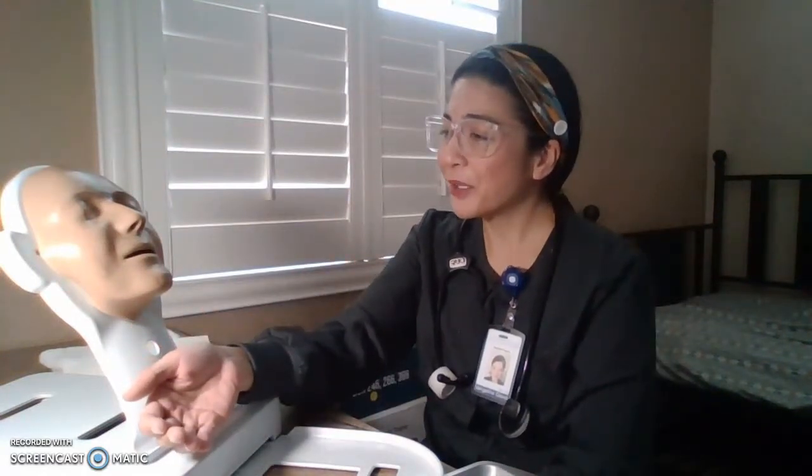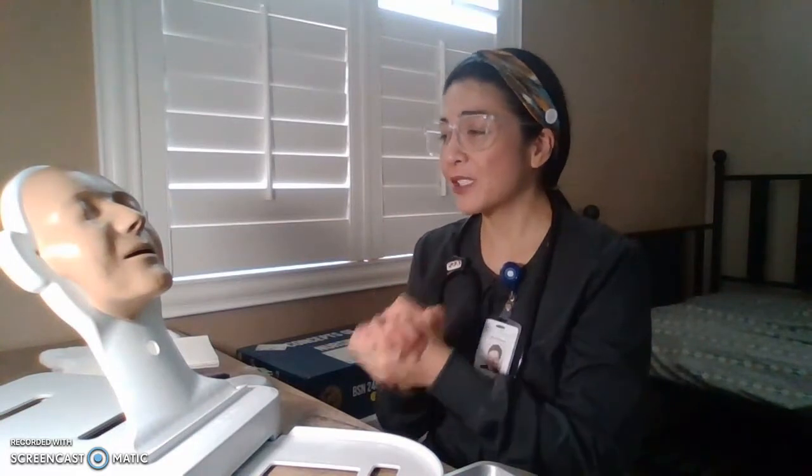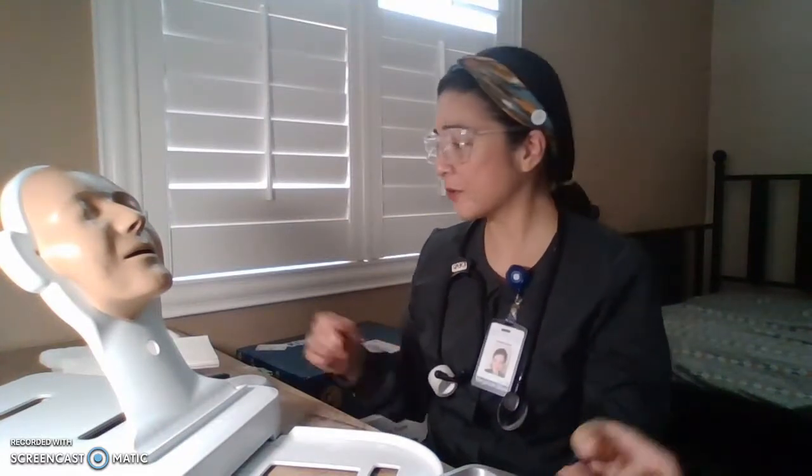Perform hand hygiene. And hi, sir, can you please state your name for me? Thank you. And your date of birth. Thank you. So, hi, Mr. Sunny again. My name is Benji David, your nurse for the day. We've spoken earlier about the procedure, this insertion, and you've given me consent. I was just wondering if this is a good time to start that. Thank you. So, you've already got confirmation.